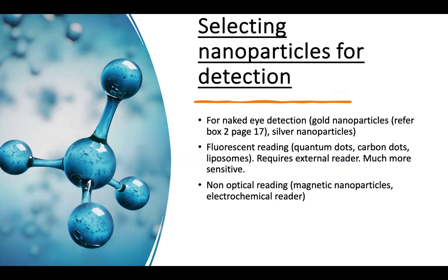Even though it's quite difficult, because for fluorescence you need an external reader for the fluorescence measurement. We cannot observe it with the naked eye.